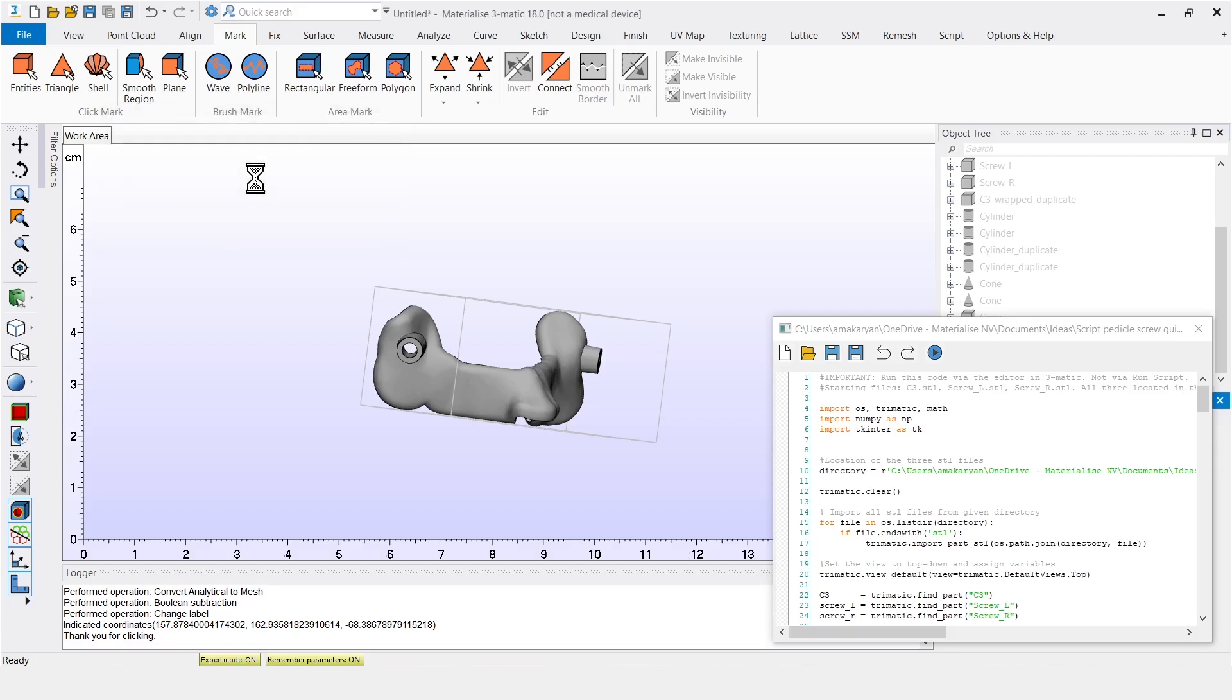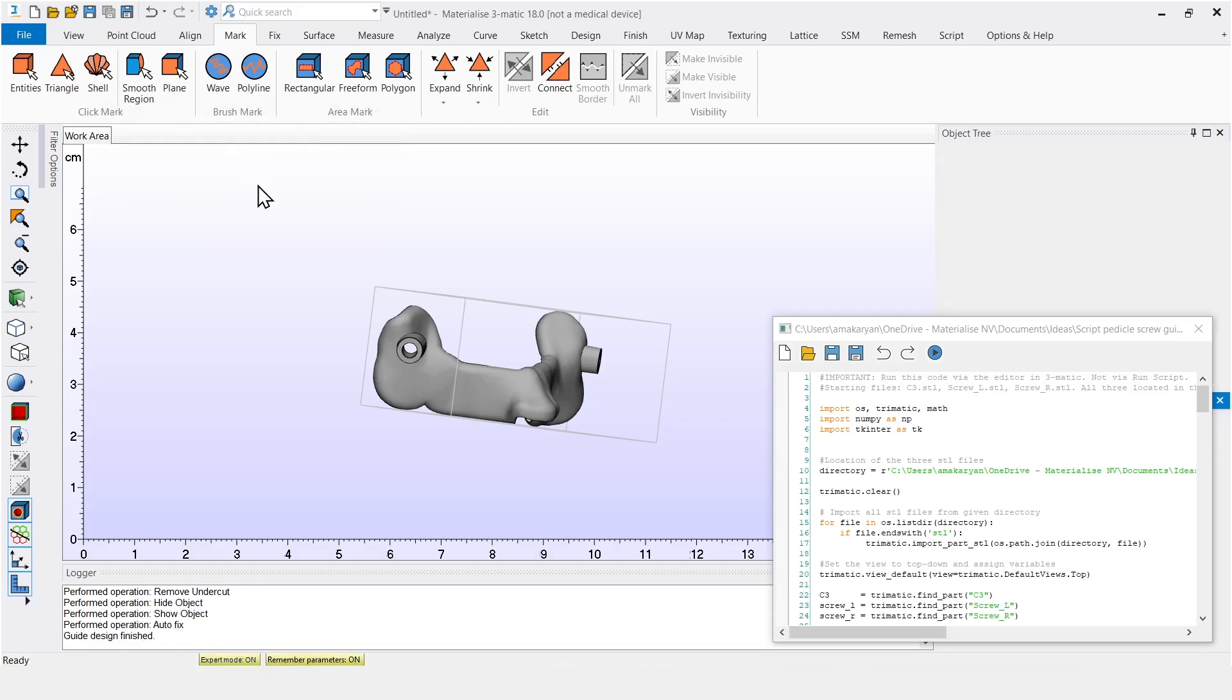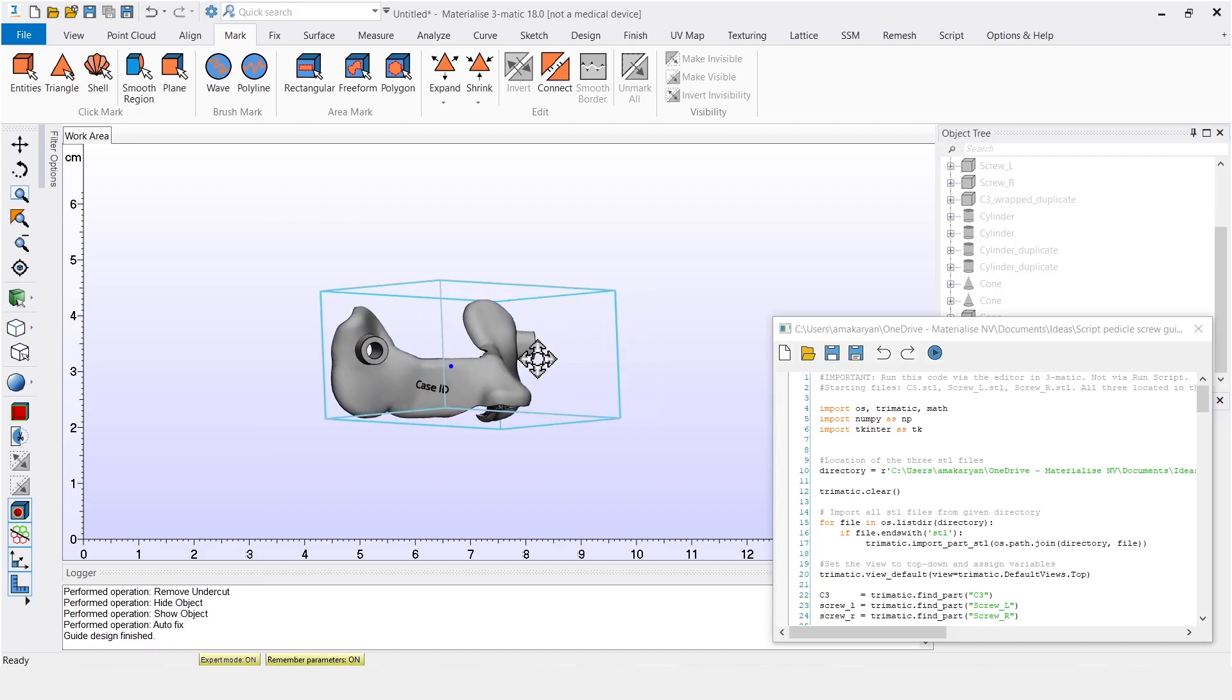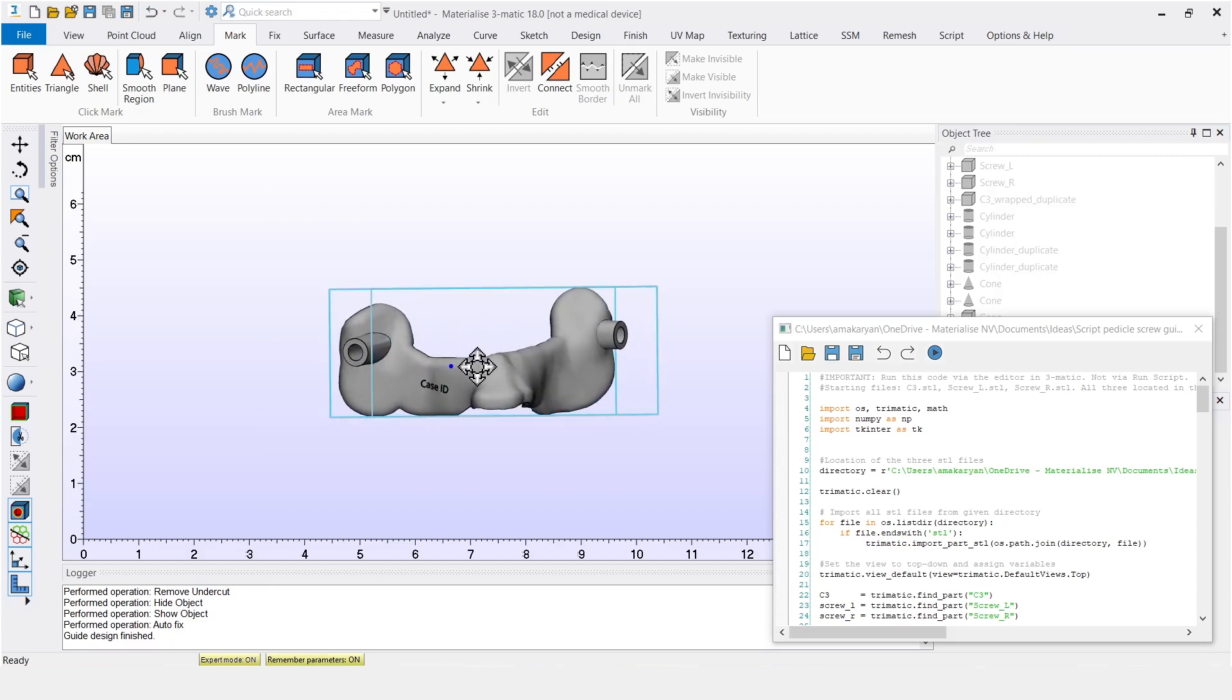After pressing enter, the guide is finished. The end result matches the one shown in the manual workflow, but now it was achieved in less than a minute in comparison.